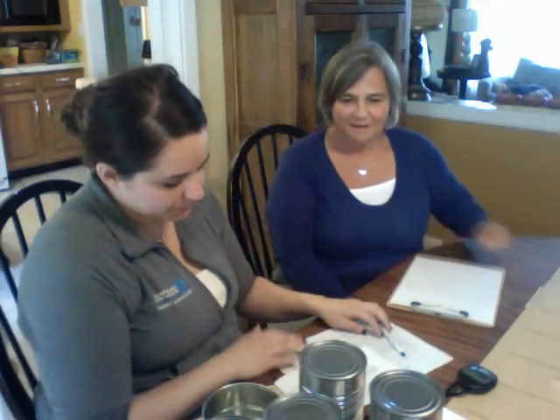Okay, so today we're going to be doing the Jebsen-Taylor Assessment of Hand Function. And we've gone through a few of it. I've kind of given you a heads up of what to expect. Are you ready to begin? Yes. All right. So, if you require reading glasses, you can go and put them on, but I think you're set since I know you and you're my mom, so we're okay.